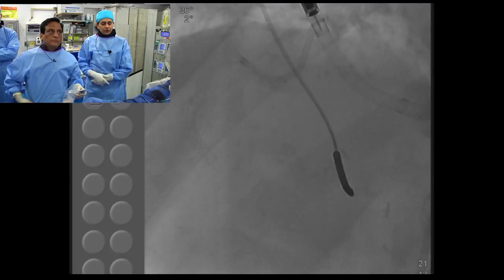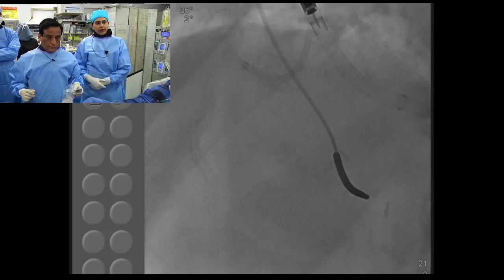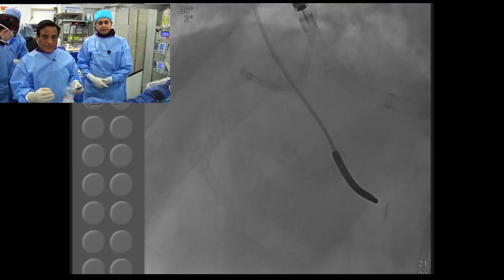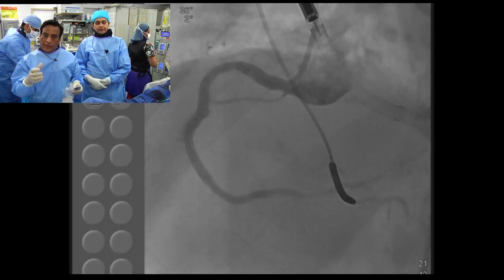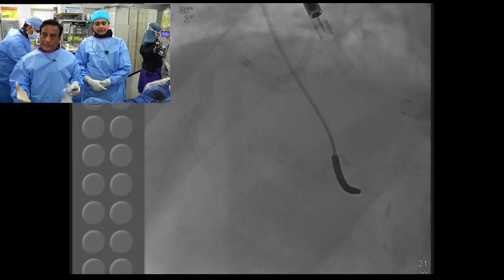This criteria is strict, and if we think it's questionable, we will not put a stent in; they will get medical therapy. That is the key crux: every case will be evaluated against that grid before stenting. Because remember, when you schedule the case, everything is okay until you do the angiogram, because one part of appropriateness is how many vessels are diseased and where the location is.